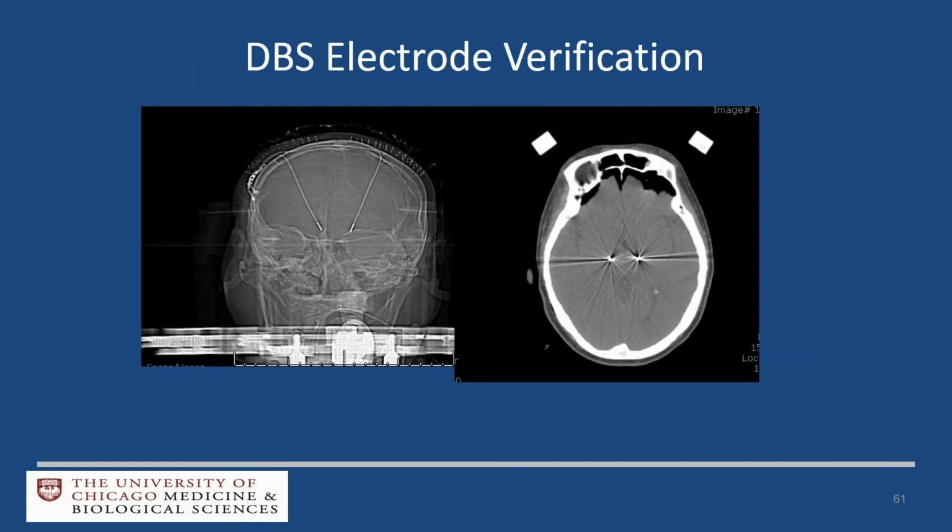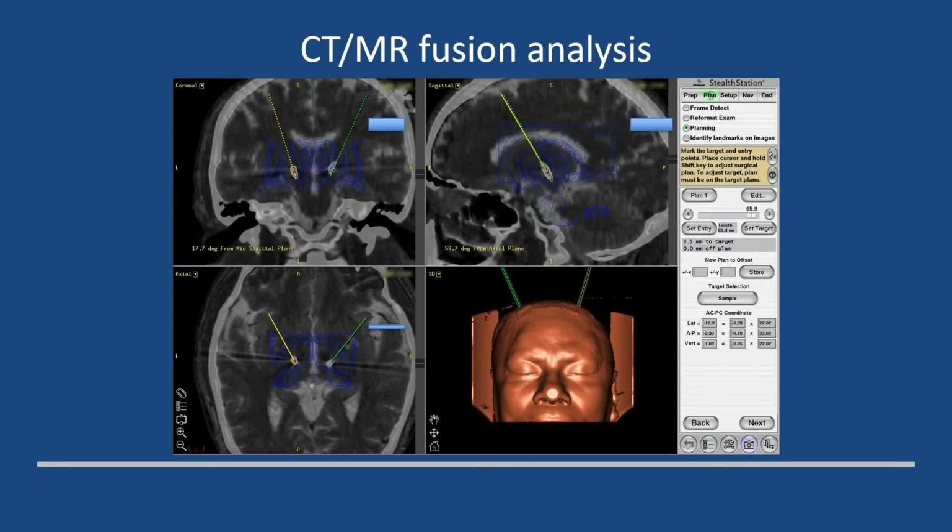This is a classical subthalamic nucleus DBS electrode, and you can verify the electrode position excellently. With the intraop CT, we always fuse it back to the MR and create what's shown in the next image, which we call hybrid CTs. This is on the Stealth: you can weigh the images, the CT 50% and the MRI 50%, so you get the best of both worlds.